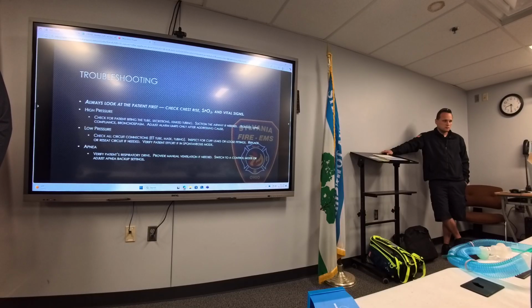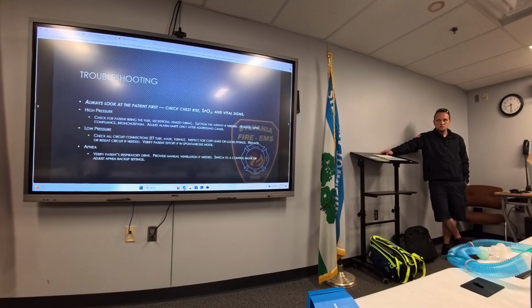Because, like I said, all the codes that I've ever worked in hospital and out of hospital, I just looked up the cardiac arrest protocol and it doesn't even mention it. With the auto vent, there wasn't really anything to yell at you. It made some funny noises, but it was always used as an extra hand, basically. That's one less person at the head squeezing a bag, giving a breath. It was consistent, and that was my assumption as to why we always did that.